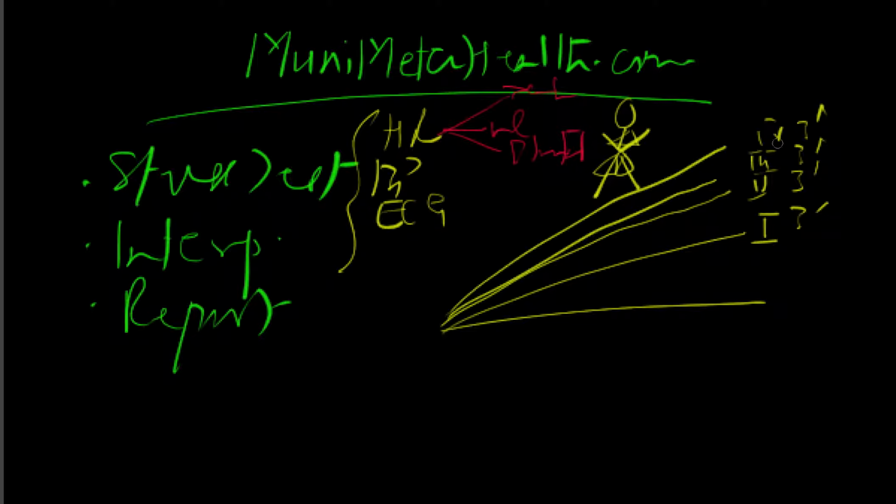You can follow the Bruce protocol, which I think is the most commonly followed protocol the world over in most stress labs. But you could also follow the Cornell protocol, which is very common, and it's a 2-minute stage, and there are other protocols you can follow, or you can just do your own modified Bruce, especially for elderly people, which I like to do past the age of 80, 85, unless they're really in good shape. But generally, I think past the age of 75, 80, you can do a modified Bruce.